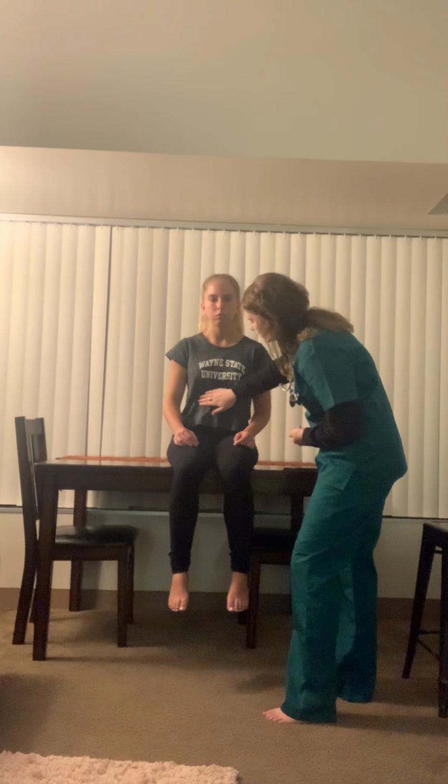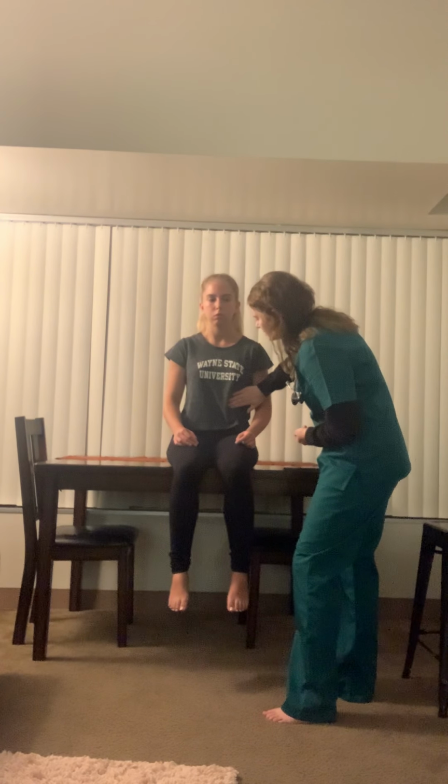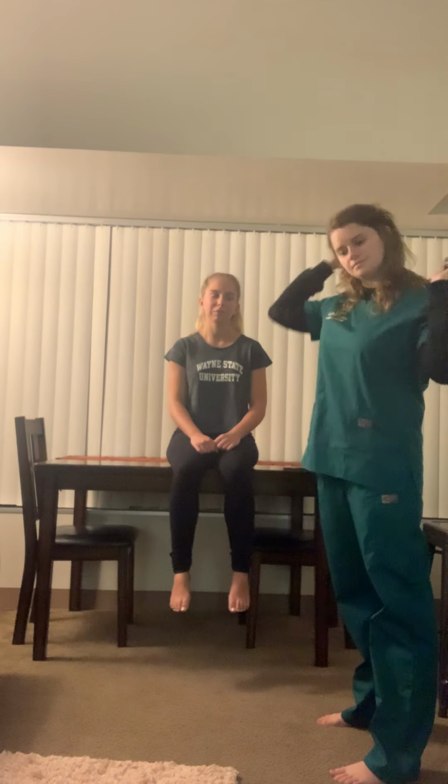And now I will look at the precordium, chest area, and I will inspect and palpate the apical pulse. I will be feeling for any heaves or thrills as well, which I do not appear to be finding, which is good. And now I will begin to auscultate the heart with the diaphragm of my stethoscope.